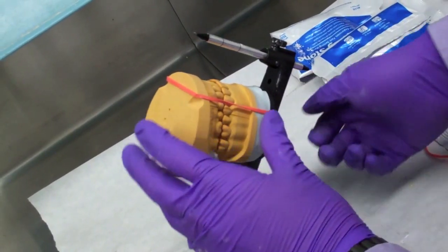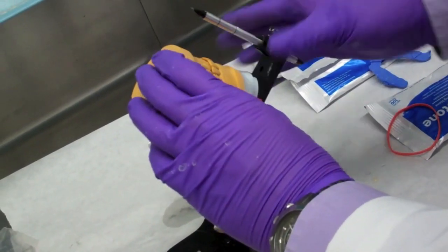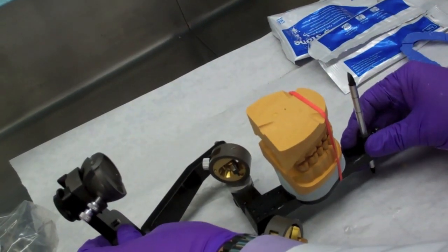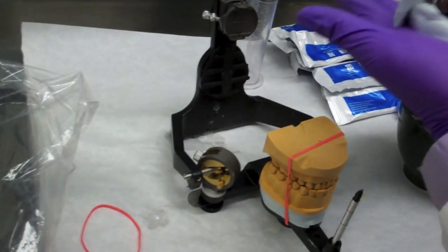We now remount the maxillary cast onto the articulator. With the rubber band in place, the mandibular is in occlusion with the maxillary. Make sure that the rubber band is not in the way of the indexes made on the bottom of the mandibular cast.